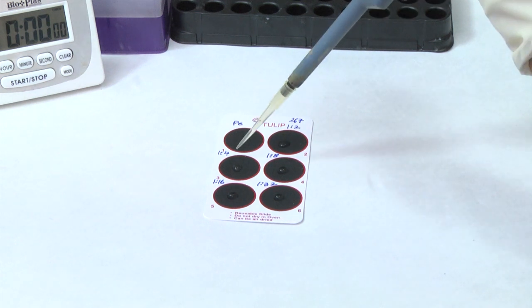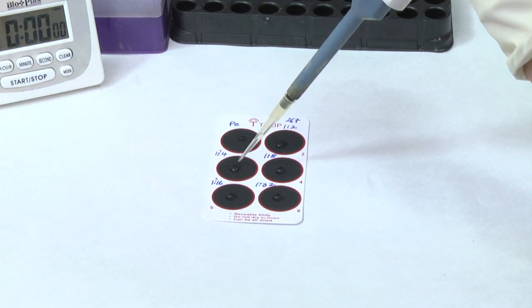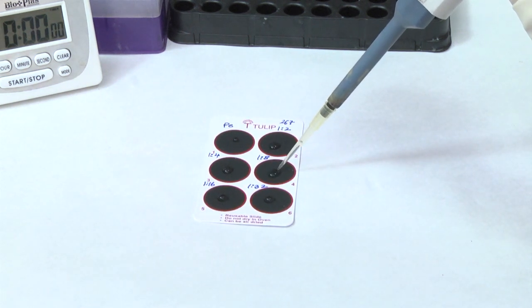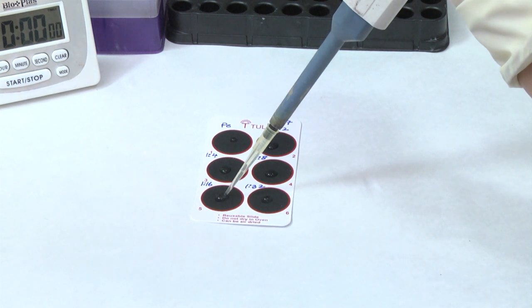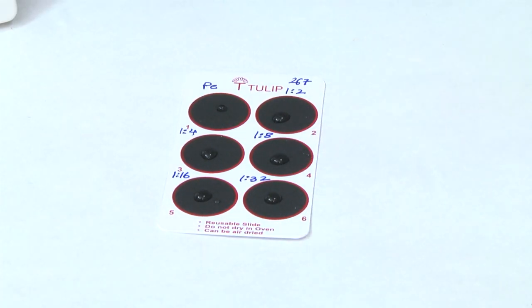Transfer 50 microliters from circle 2 to circle 3 and mix. Transfer 50 microliters from circle 3 to circle 4 and mix. Transfer 50 microliters from circle 4 to circle 5. Mix. Transfer 50 microliters from circle 5 to circle 6 and mix. Discard the last 50 microliters.